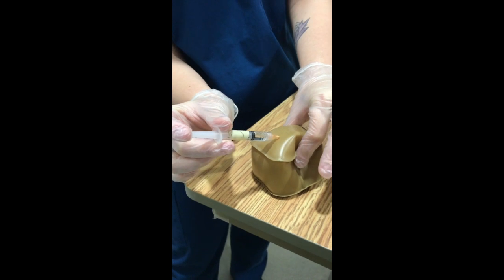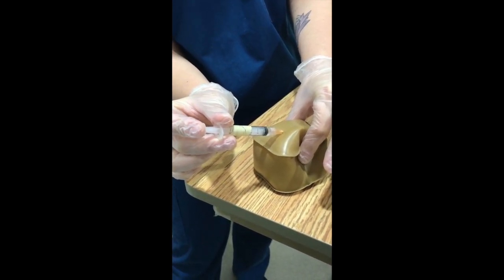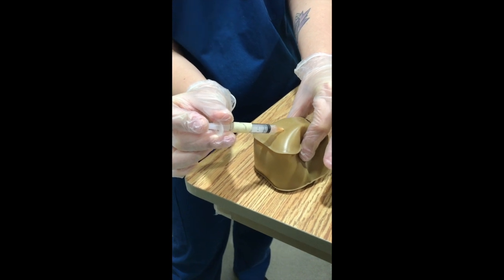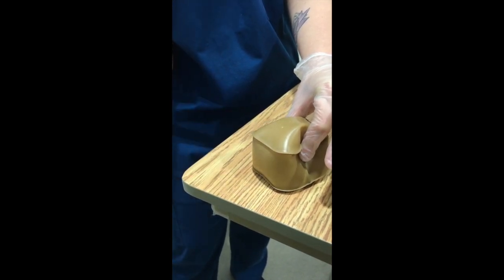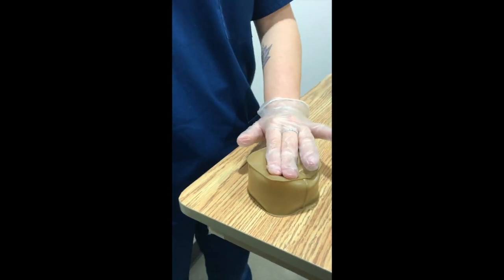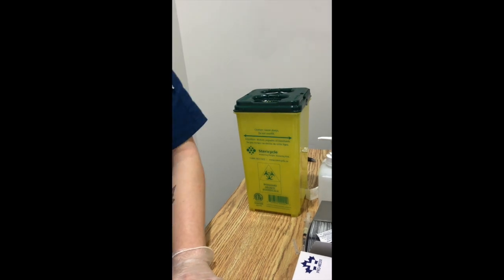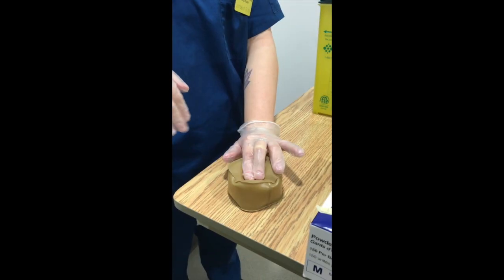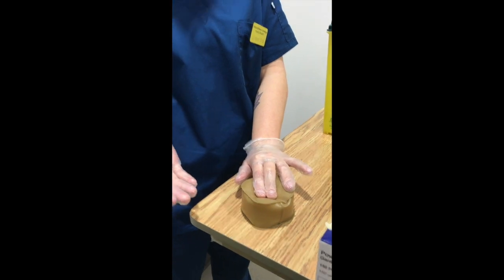like that. And then you're just going to inject slowly, as well as keeping the bevel of the needle up. And then once it's injected, you're going to pull swiftly out and then just apply some pressure, as well as putting the needle directly into the sharps container. With heparin, we want to apply pressure for about 2 minutes just because it is a blood thinner. So we want to make sure that it has enough time to clot.